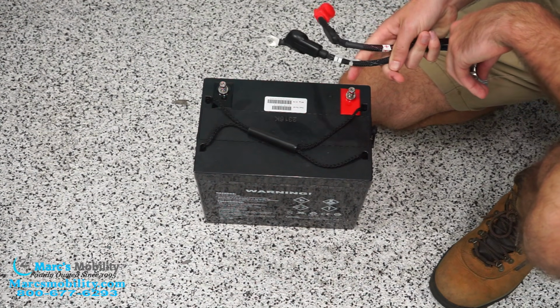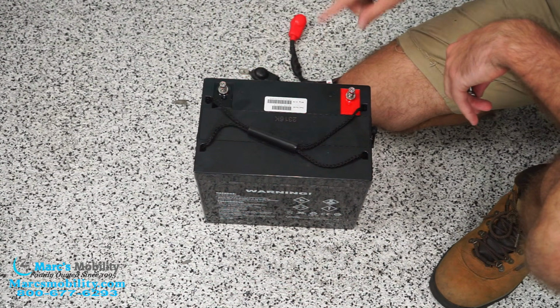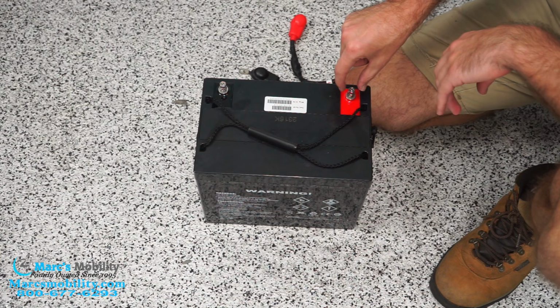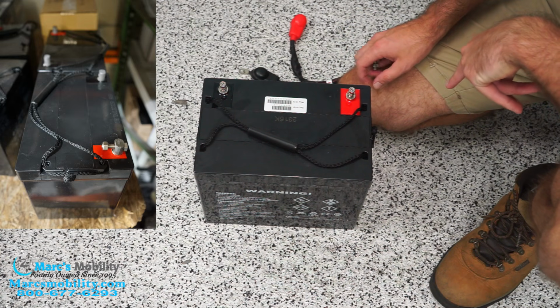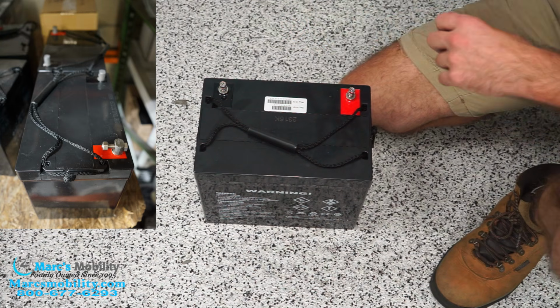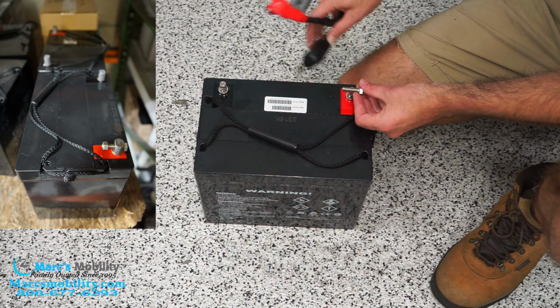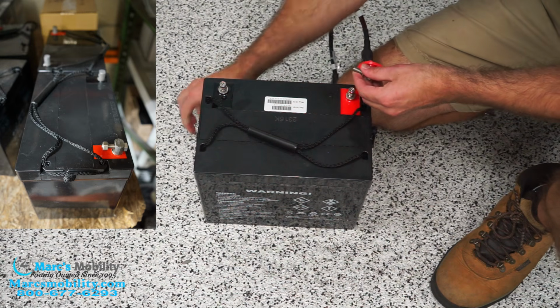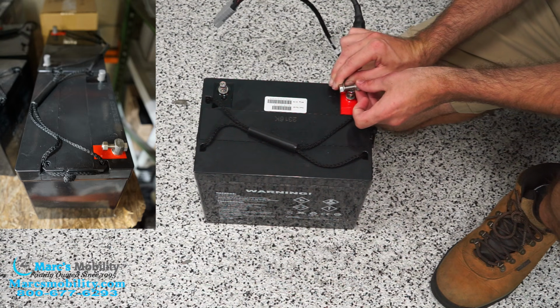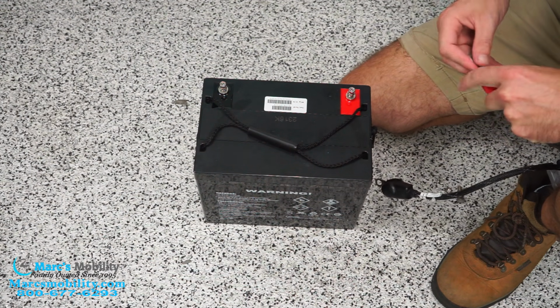Now we're going to put our cables on the new batteries. I do want to say that these are recessed post batteries, meaning that the posts go into the battery. If you order batteries from us or from a lot of other suppliers, you might have flag post batteries, which I'll show a picture up in the corner in an overlay. But essentially you'll have these posts that go up, and you'll have a bolt that goes through the posts. So it mounts a little differently, but we can still use these cables. Basically, you would put this through the post, attach the correct one over, then you'll have a nut, and sometimes a lock nut as well, or a lock washer, tight to the post, and then that's how it would attach. But you also might get these recessed posts again. That is what it comes with. Both types of batteries will fit in this unit. They are the correct batteries if you see that.